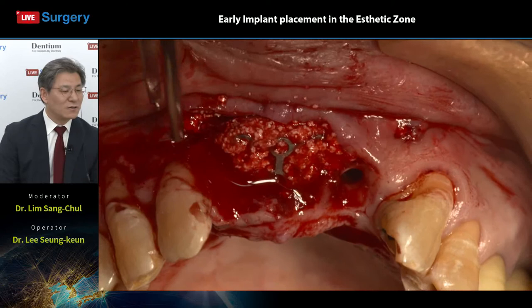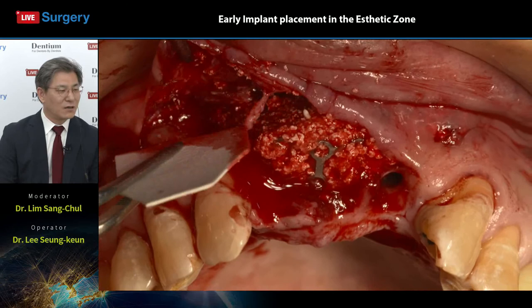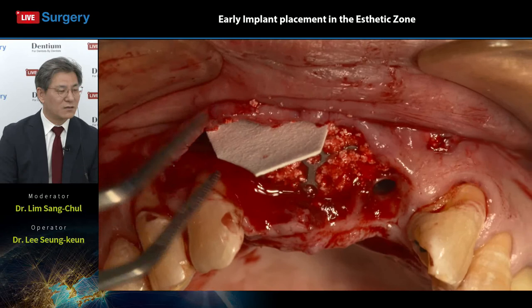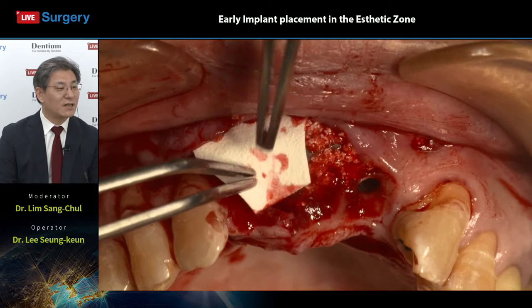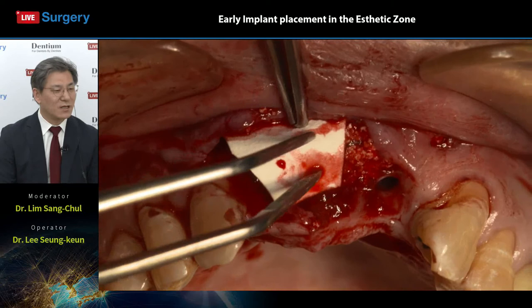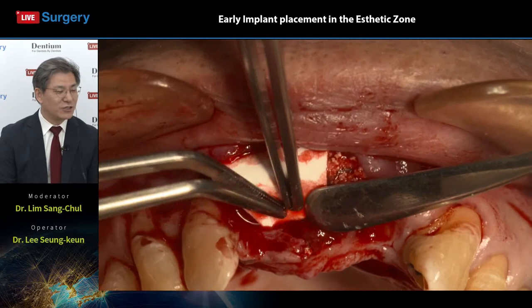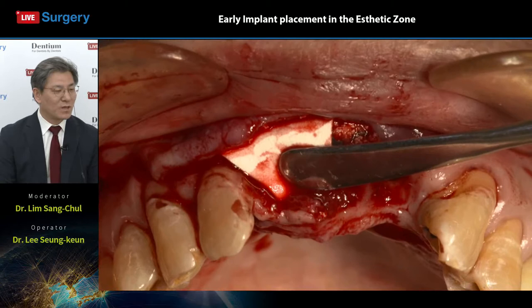In dry condition, because I use a stiff collagen membrane, like this one, it stays separate from the bone graft material. We have something in common, Dr. Lee and I. I always use this collagen material in a dried state, under the collagen membrane and under the flap. When I use this Dentium collagen membrane, in dried condition, trimmed, I just put this membrane on the surgery site and soak it with blood like this one, right? So it is enough. This kind of usage has lots of benefits.